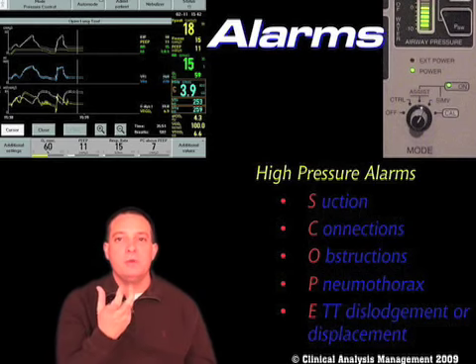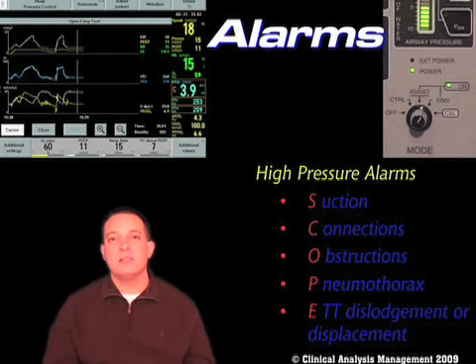In contrast, if the ET tube had been dislodged and was now sitting in the esophagus, most likely we would see a low pressure alarm.